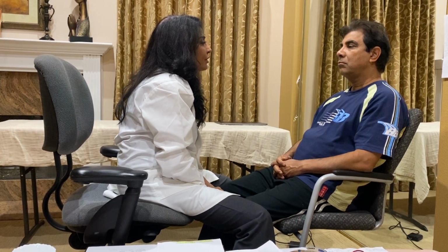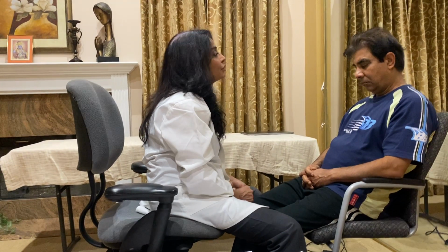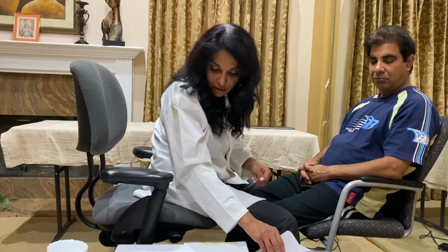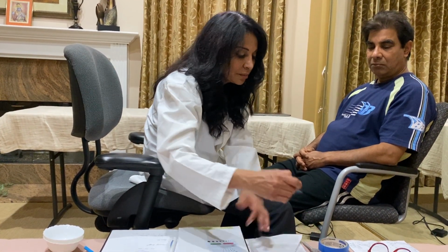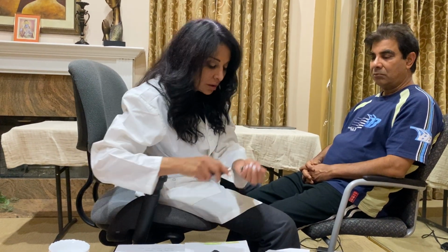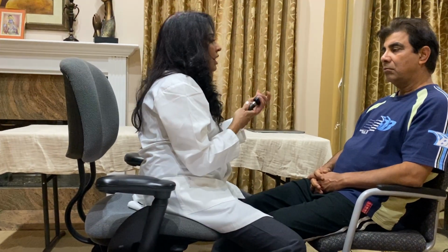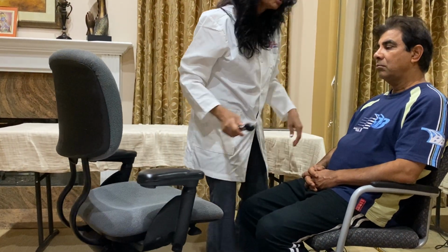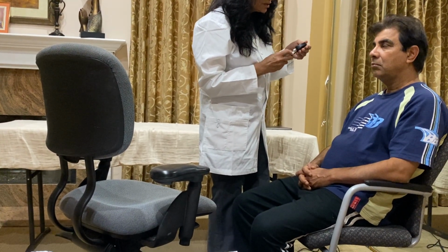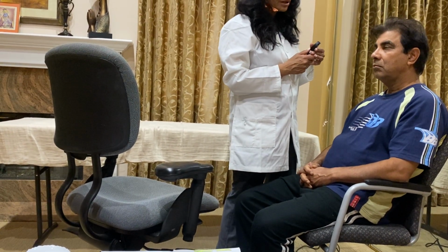That concludes my eye exam for him, and now I am going to do the ophthalmoscopic exam, which is actually an important exam. And let me find my ophthalmoscope. In my ophthalmoscopic exam, I am going to go close to the patient. So I'm going to examine your eye. I'm going to turn the light on. It is very important to consider the safety of the ophthalmoscope.